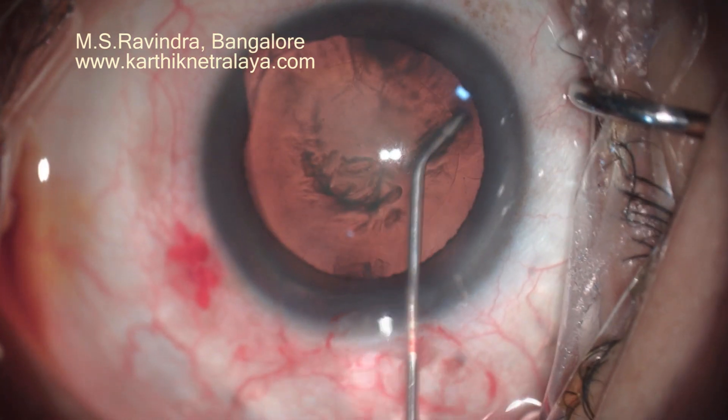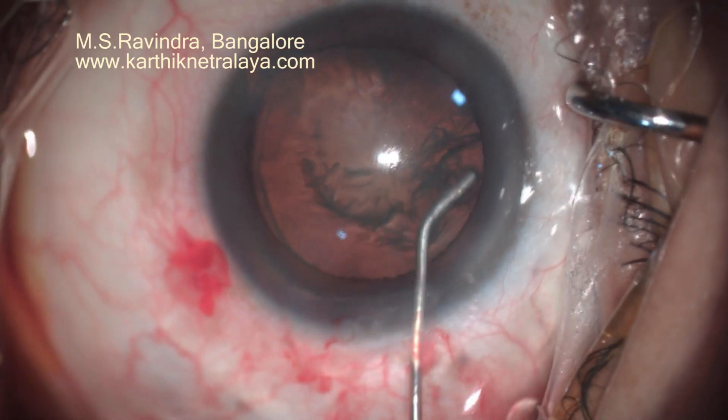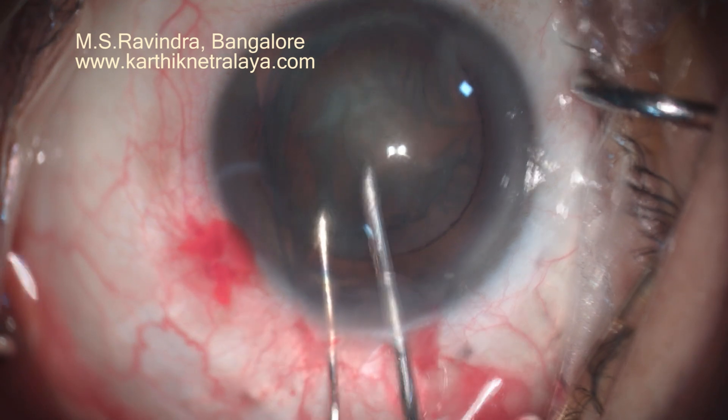It is a single entry into the eye; there are no side ports needed. Hydrodissection is done away from the coloboma area. It is a capsular-separating hydrodissection.